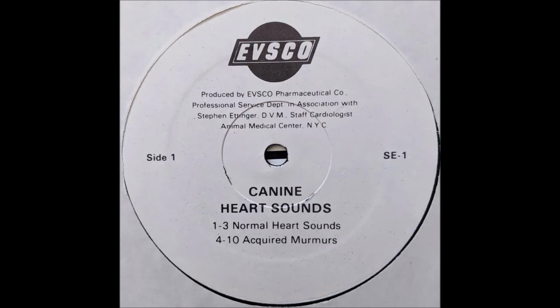The systolic whoop, or seagull murmur, is a variation of the holosystolic murmur heard with atrioventricular valvular insufficiency. Notice the high frequency and musical quality of the systolic whoop.